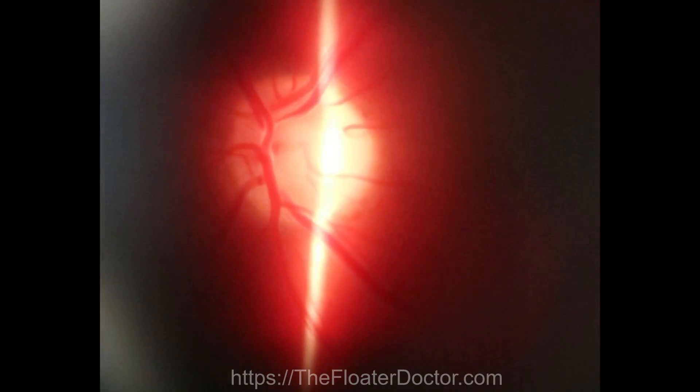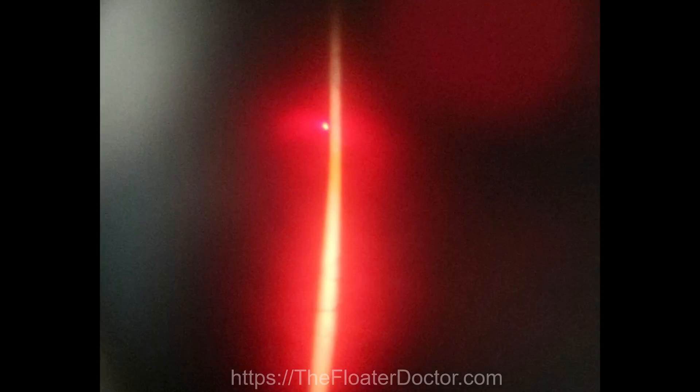That may have been the target of previous treatment elsewhere, but I don't think that's the actual problem. The hard part is pushing the focus further back. Going back toward the retina — there's our optic nerve. It's a left eye, so we slide over to the right and get close to the fovea. Just in front of it, using retro-illumination, there's a little density there and another one just to the side. These are microscopic — there's a little linear connection between them, probably not visible on video, but those are the little densities.